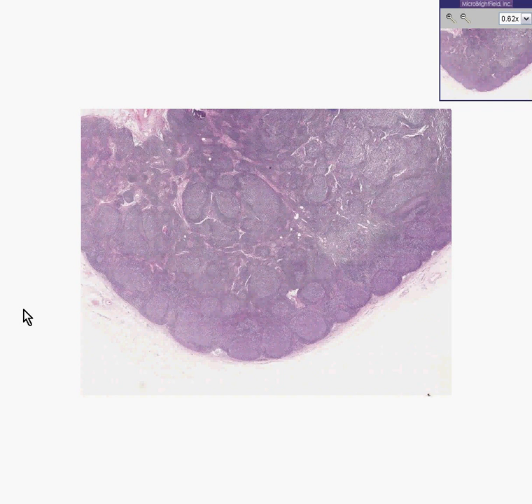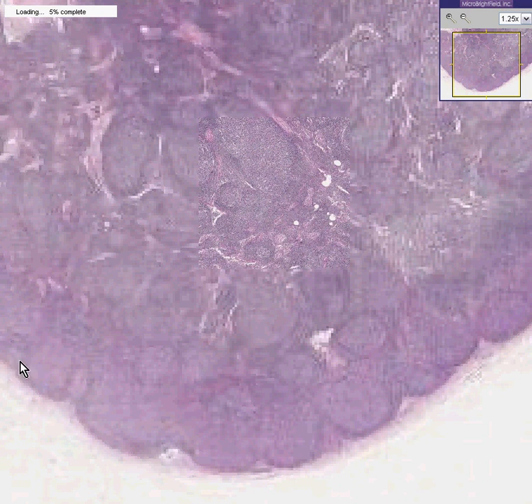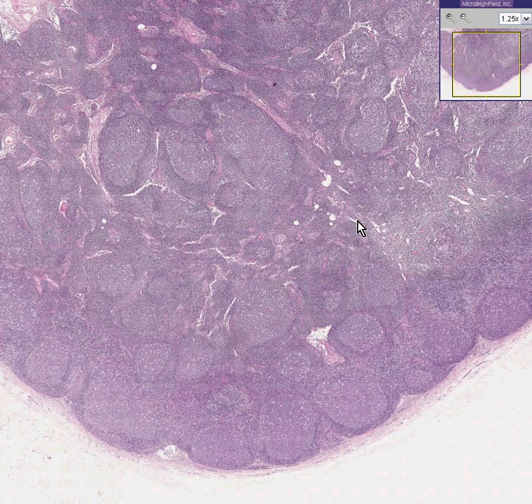Well, in this lymph node, we can see, compared to all the other nice normal textbook lymph nodes that we've seen, that the overall architecture is preserved, in that you generally see nice well-formed follicles, and more towards the center you get these straighter linear areas like cords. However, if you have looked at even a few lymph nodes, you cannot deny the fact that these follicles, which should be limited to the cortical area generally, are larger and more numerous than they should be.